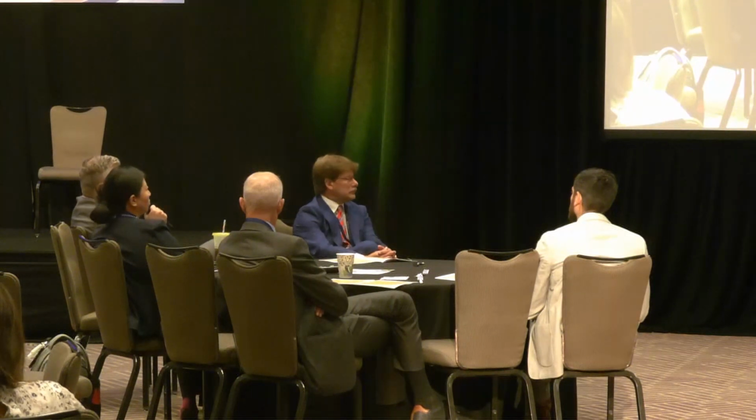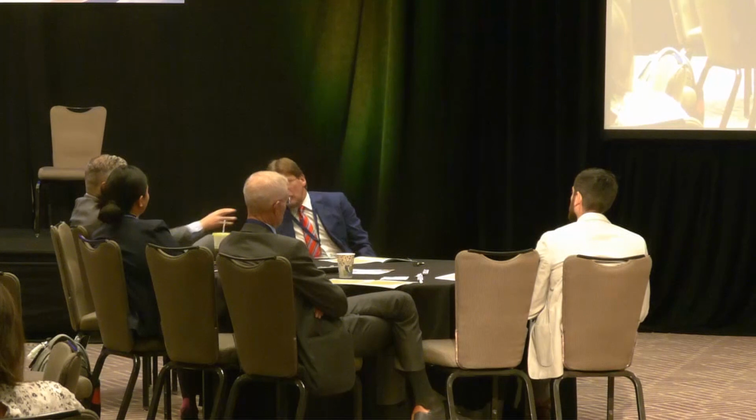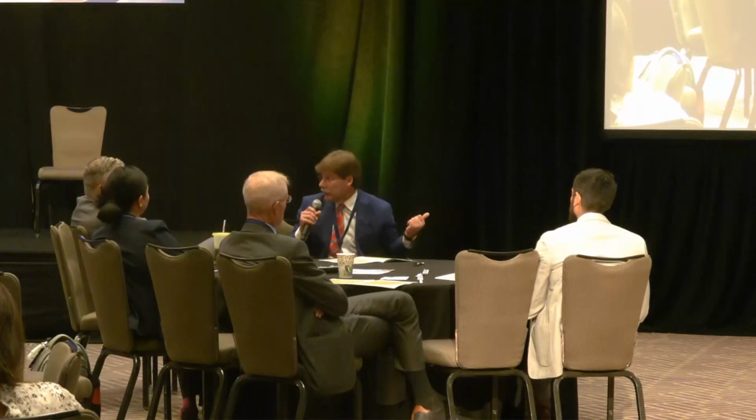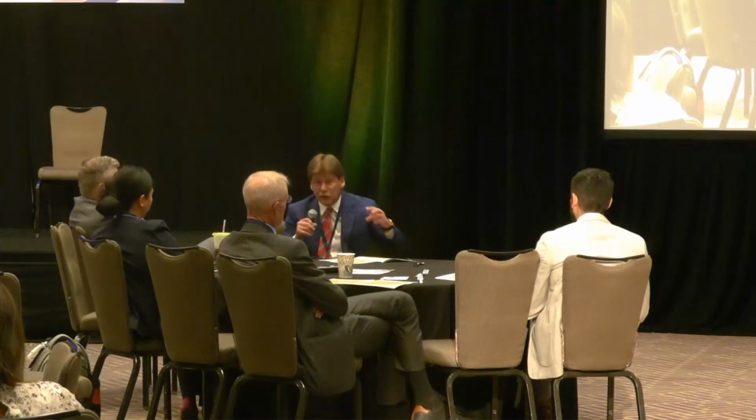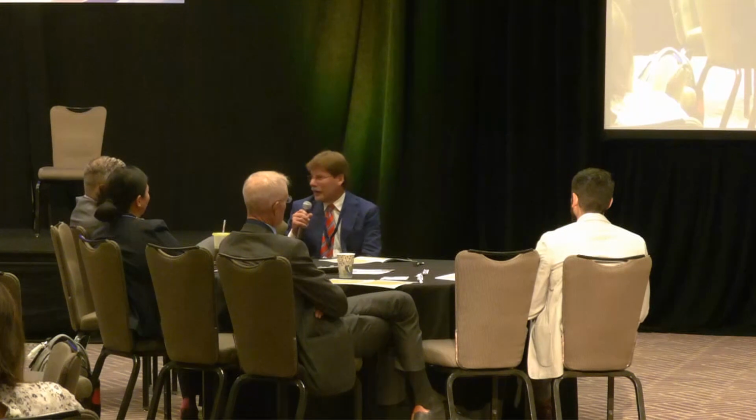And so the concerns for undersizing what you're doing kind of creates that scenario. I probably would try to size it still 1-to-1 to that distal edge. I don't know, Chris, would you go bigger? I think you're going 1-to-1, and I think I would go 6.5, somewhere in there, because if you get too big, it's going to start to elongate, and then you lose it. And you've already got a club sandwich in there. You've got a triple stent layer. You don't want to elongate this.